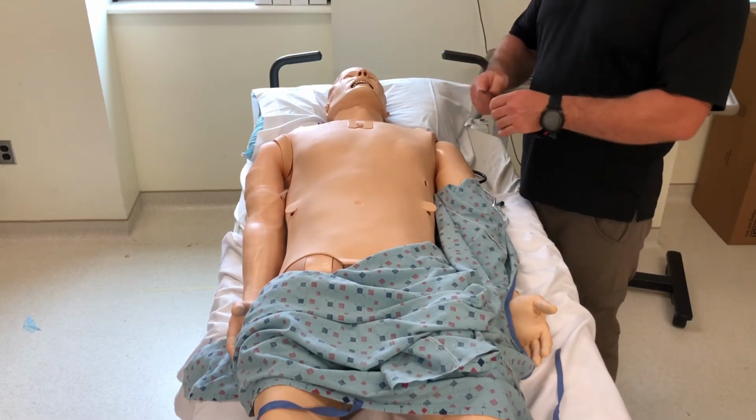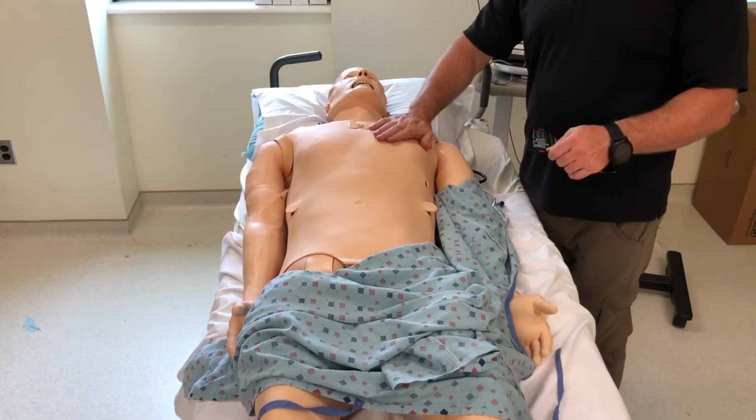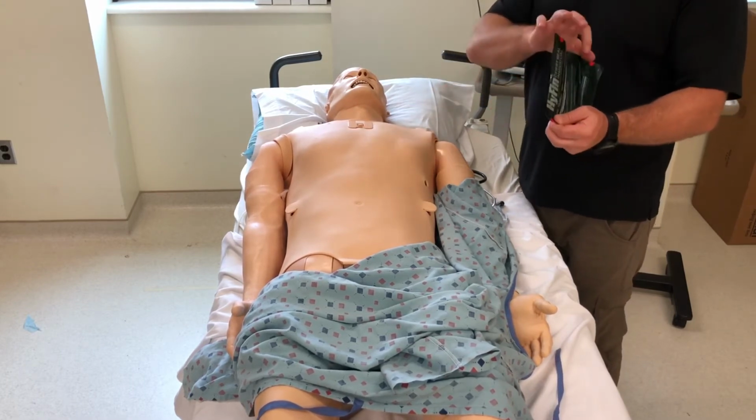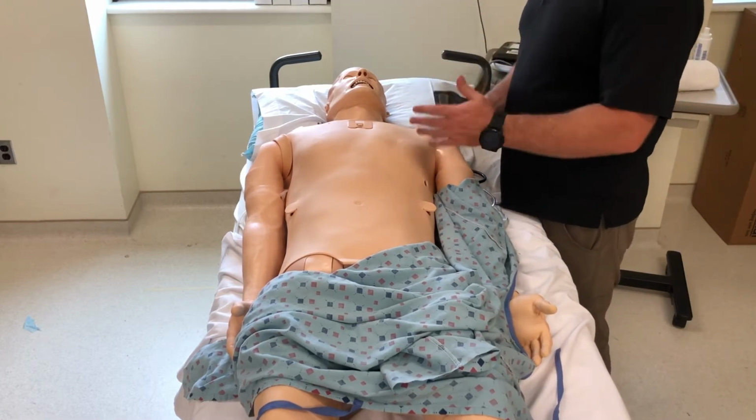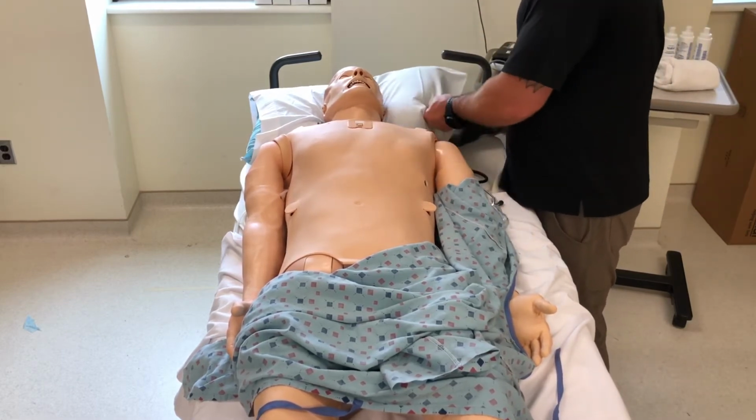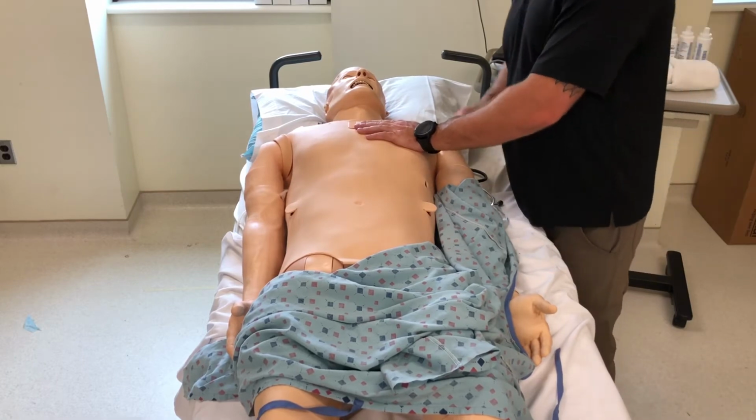For this guy, if I have an exit wound, I open it up. I can stick that seal on there. I can use the plastic covering for it, or I can use this, tape it to the back as a 3-sided dressing. So let's say I had an open chest wound. I sealed it off. Chest wound sealed. So now what I'm going to do is just assess again.